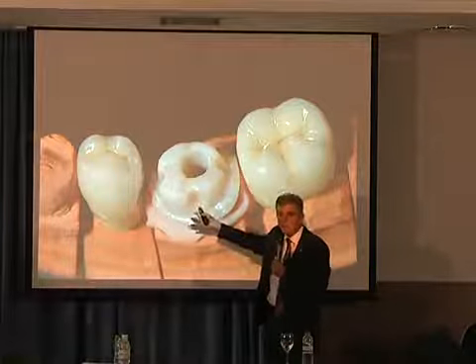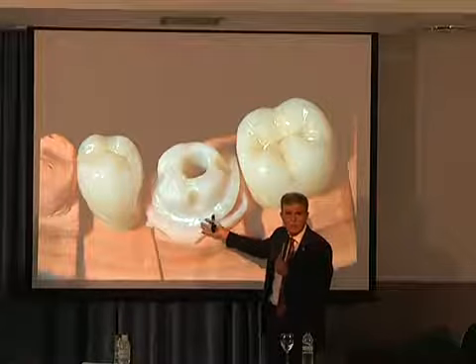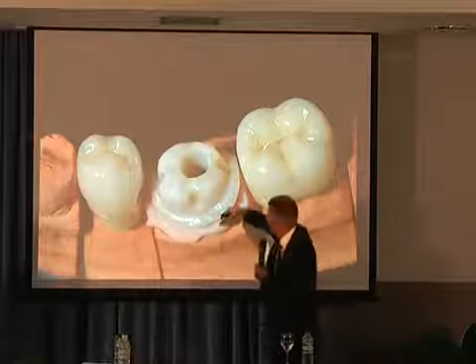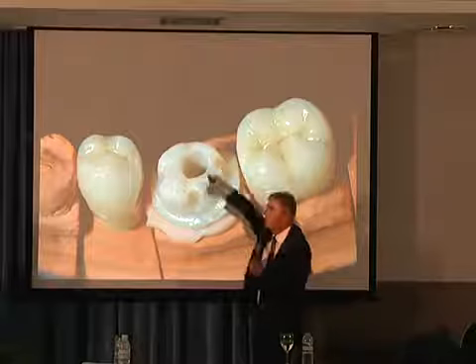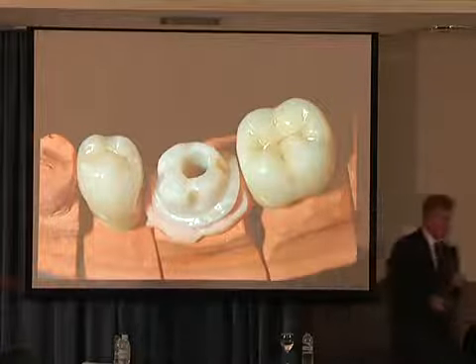And this is surprising now, above the tissue. It's a molar. Why not? Above the tissue, on the tissue level. And it looks like a natural molar after milling. After the preparation. After the preparation, exactly.